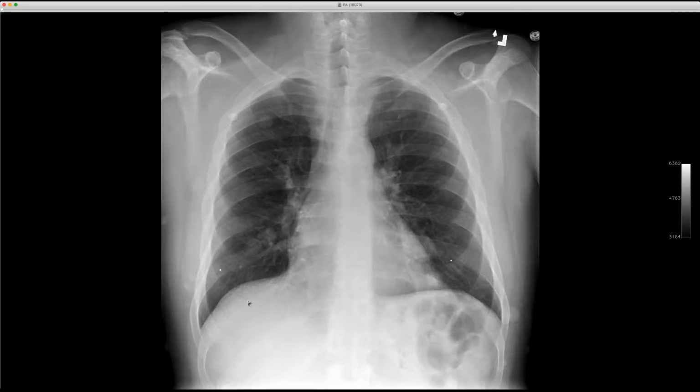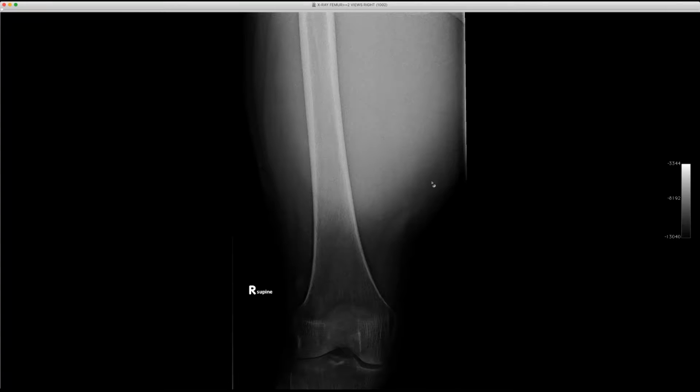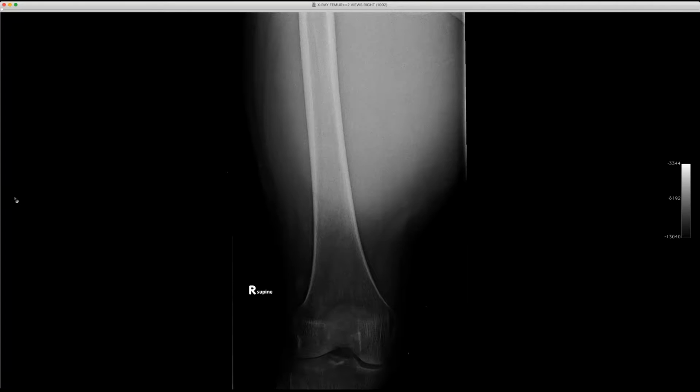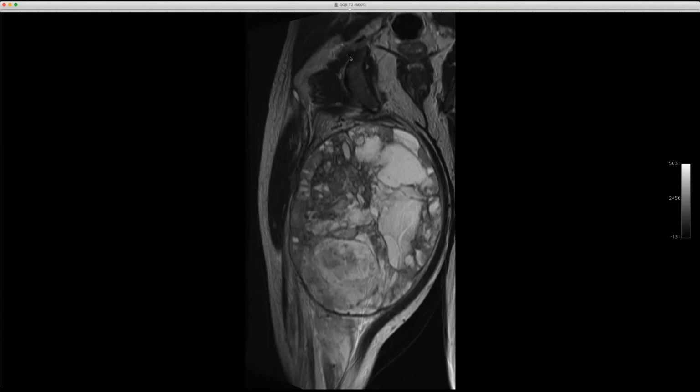So, patient has a long-standing illness, and if you've already picked it up, you probably already know the diagnosis. But you've got all these lung nodules and all these skin nodules. And this patient presented with a thigh mass. You see the swelling, and then here's a better view down low. Big thigh mass. And if I go back to the radiograph, you can see more skin lesions here. And I threw the MR in for fun just to show you just how ugly the thing is. It is a big guy.